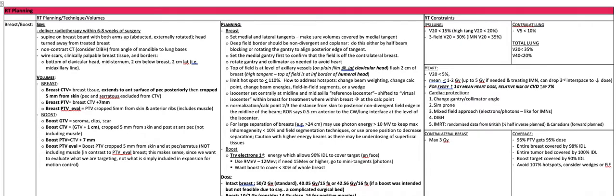For breast volumes, the breast CTV is the breast tissue, extending to the anterior surface of the pec posteriorly, and cropped at five millimeters from the skin. The pec and the serratus are excluded from the breast CTV. The breast PTV is a seven millimeter expansion on that, again cropped at five millimeters from the skin. The breast PTV eval is the PTV cropped five millimeters from the skin and from the anterior ribs, and it includes the muscle.